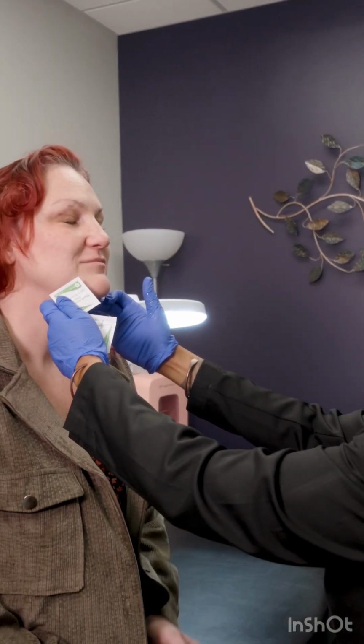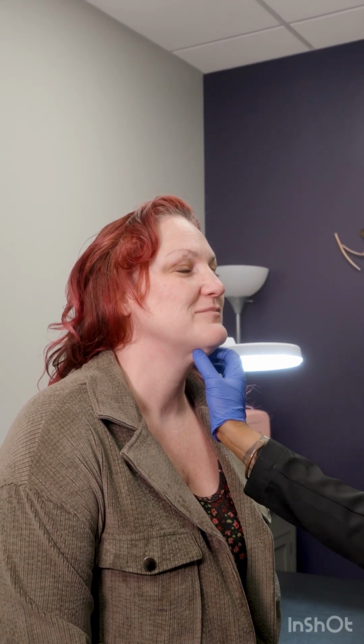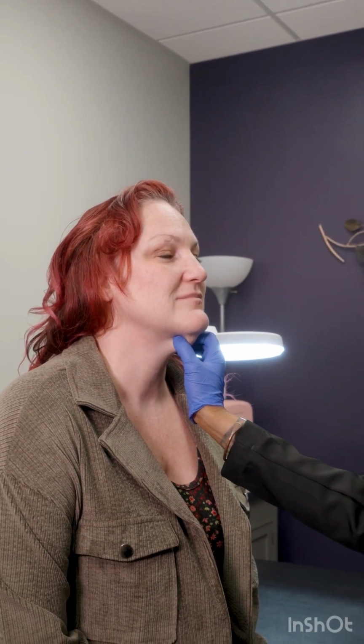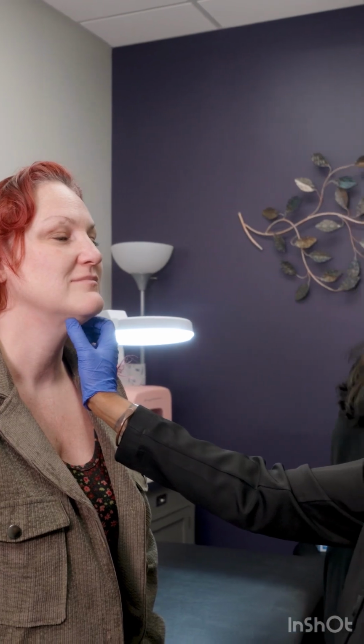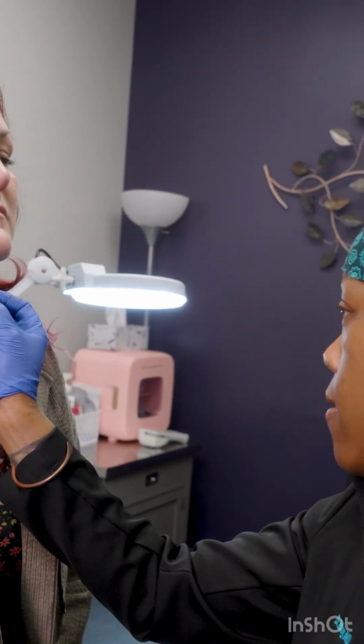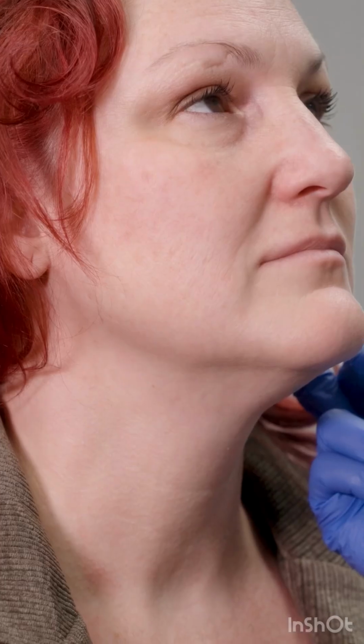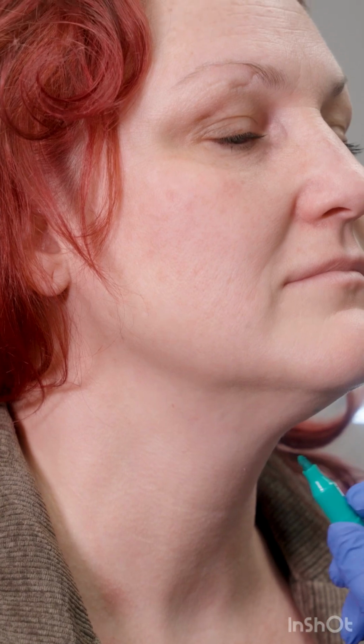Today we are going to complete a PDO thread neck lift for our patient here. She has been plagued by loose skin under her submental or below the chin area. First, I demarcate the area that I will be treating. That way, we have an established roadmap.